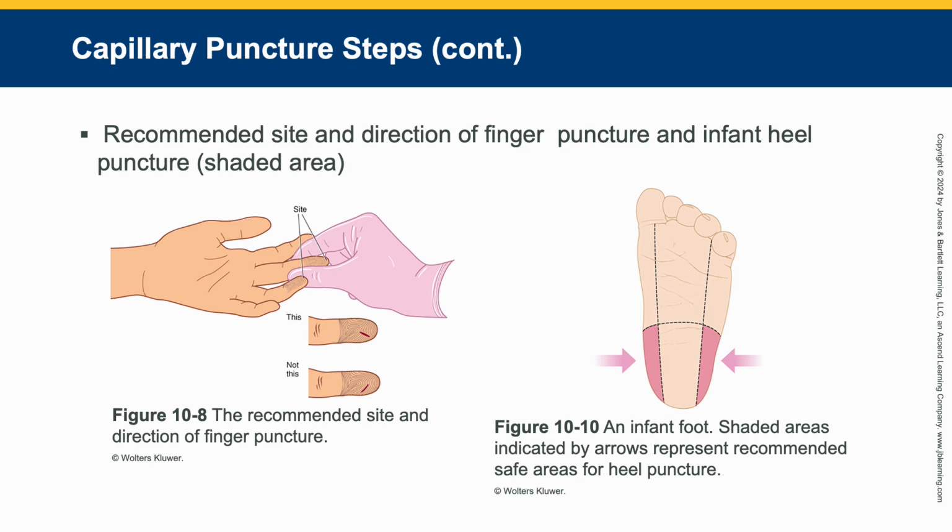Figure 10.10 is the infant foot. Remember, we don't get in that middle. You don't get the very, very bottom. You don't get the back. You're going to get the sides. So that shaded area shows you where it is safe to do a heel puncture.